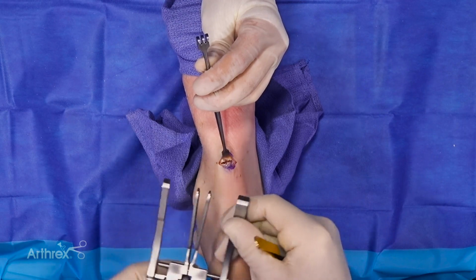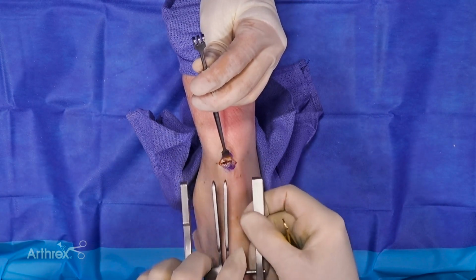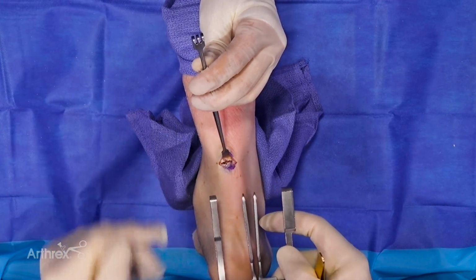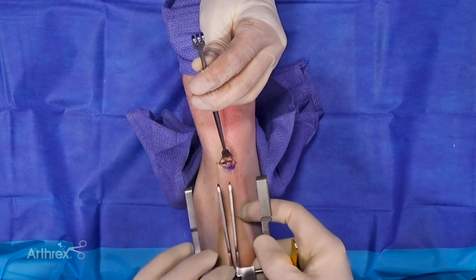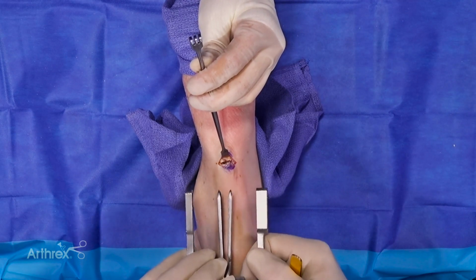You want the PARS, these inner tines of the device, to be inside the pseudosheath. That ensures that when you pull your sutures back out of this transverse incision, those sutures will indeed be inside the pseudosheath, thereby protecting your sural nerve from any iatrogenic injury.